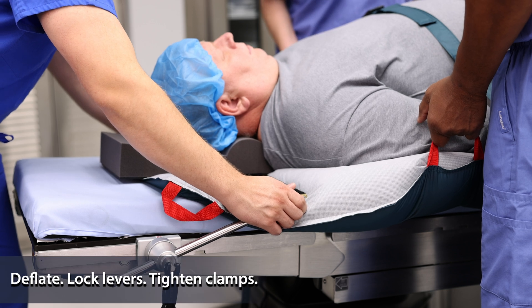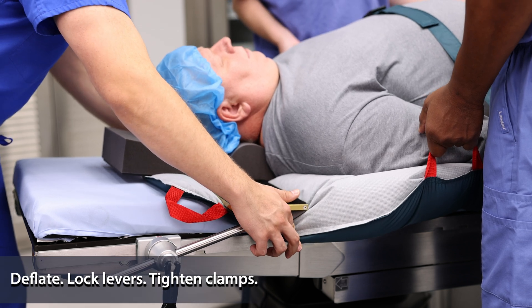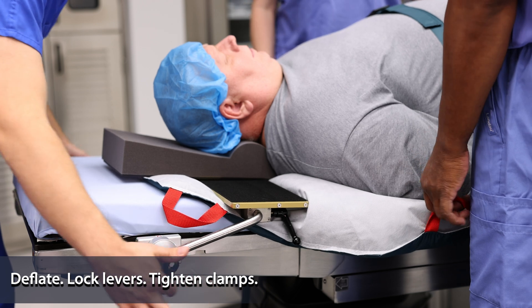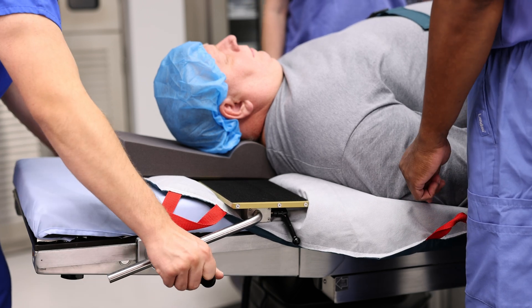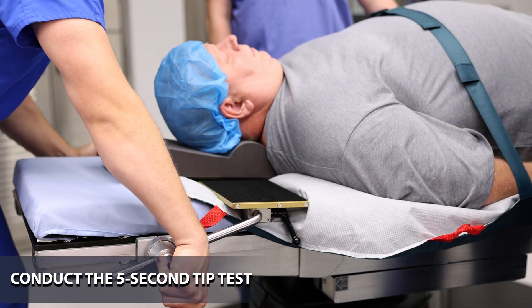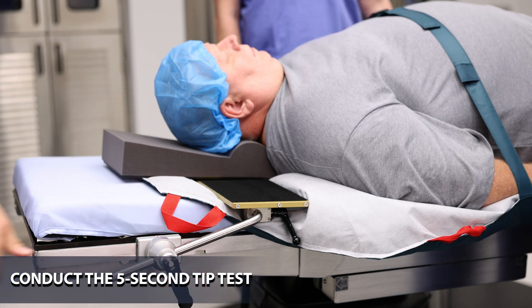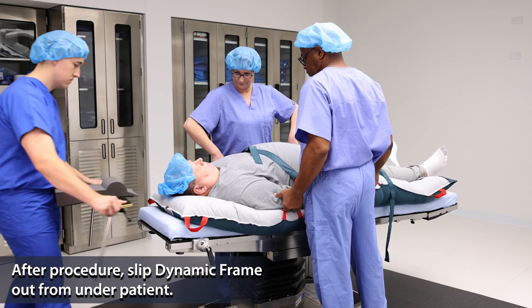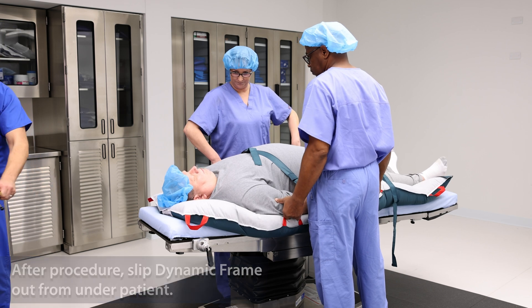When the patient is in position and the transfer device is deflated, lock the black levers, fully tighten clamps, and perform the standard tip test to ensure patient stability. After the procedure is completed, remove the dynamic frame by simply slipping it out from under the patient.